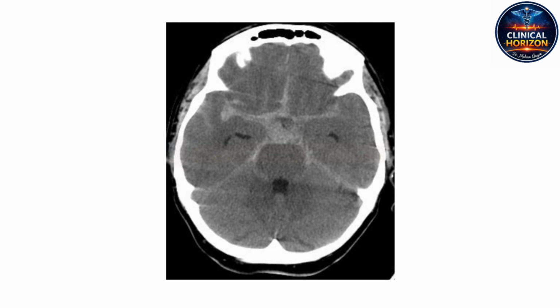While severe trauma can cause this, the most feared spontaneous etiology is the catastrophic rupture of a berry aneurysm. Usually in the circle of Willis, right? Very frequently located at the anterior communicating artery within the circle of Willis, yes. Given how fast the hallmark symptom, the thunderclap headache, comes on, what's the immediate next step when you spot that white star on the non-contrast CT? You know there's a bleed, but the CT doesn't show you the precise vascular defect.